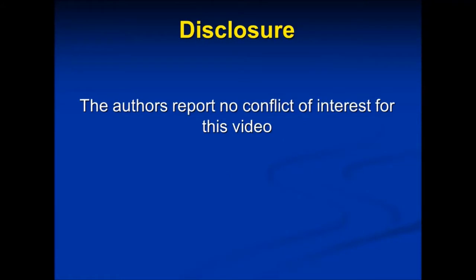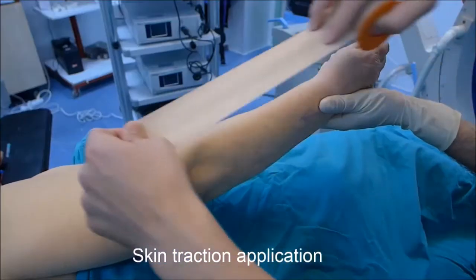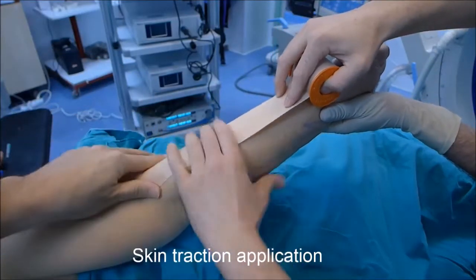This video describes a cost-effective traction assembly alternative for shoulder arthroscopy in lateral decubitus position.